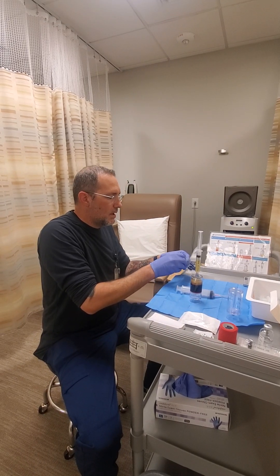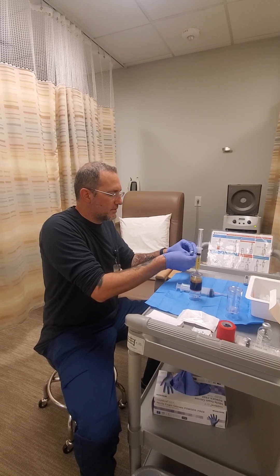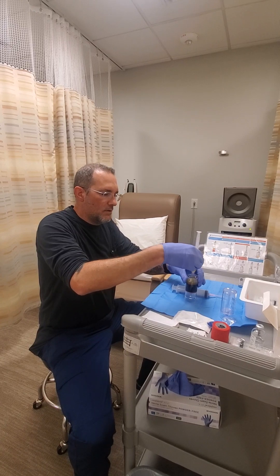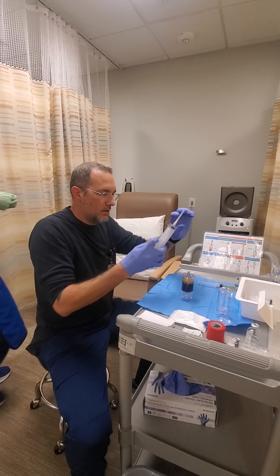After that we use what's called the super shot solution for this one, which helps concentrate all the good things in the blood down a little bit better. That is in here.